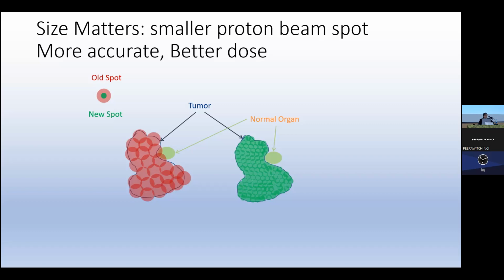So you need a big size to get smaller spots? No, you need a well-designed system. You could have a compact system with a high dose rate and a small spot size, but just because it's compact doesn't mean they properly did it. Take the system that's installed here, you see that it's going directly, there's not a bend. In a cyclotron system, you usually have your energy degrader, these plastic fingers, and that gets you from your 250 or 230 down to your 100 MeV.